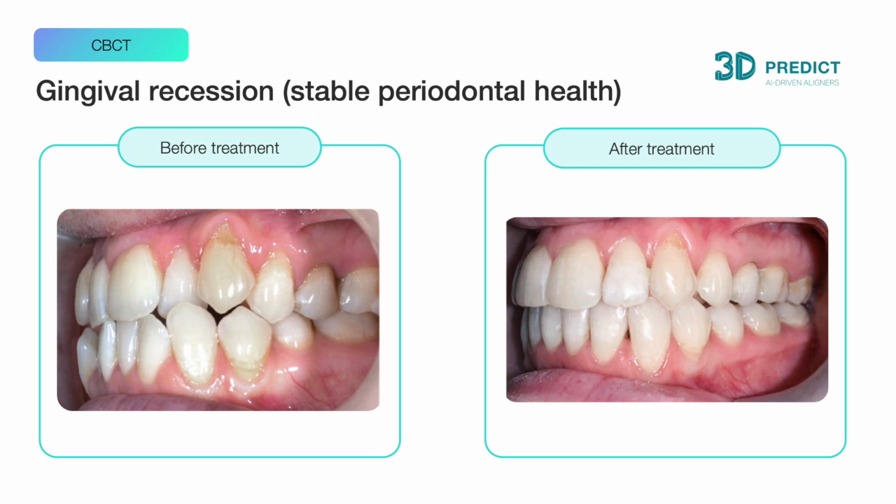Please note that research indicates that periodontally stable patients can be treated orthodontically. Although we do recommend close periodontal follow-up and more frequent visits, and even a periodontal consultation depending on the case. Regardless, the fact that these patients may have bone recession, which may not be apparent clinically, makes a CBCT imperative. Also, keep in mind that if there is bone recession present, biomechanics will change as the center of resistance will be affected.